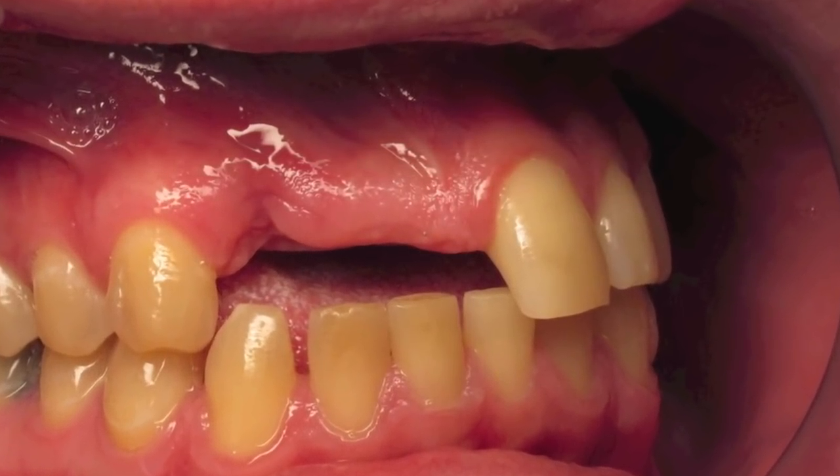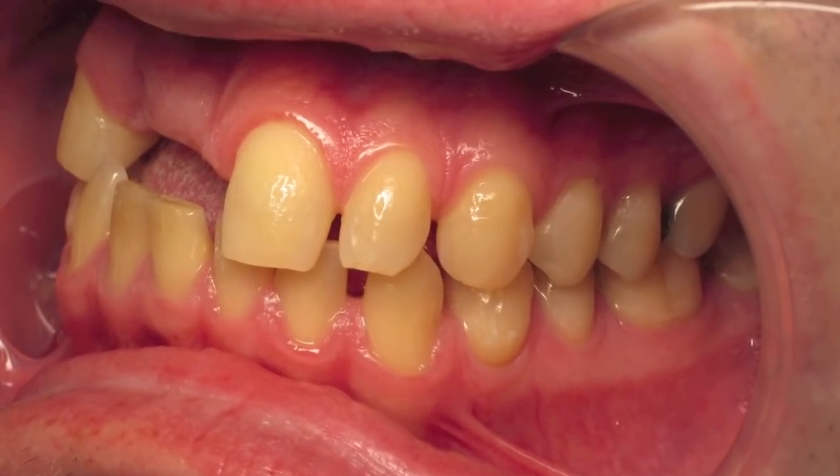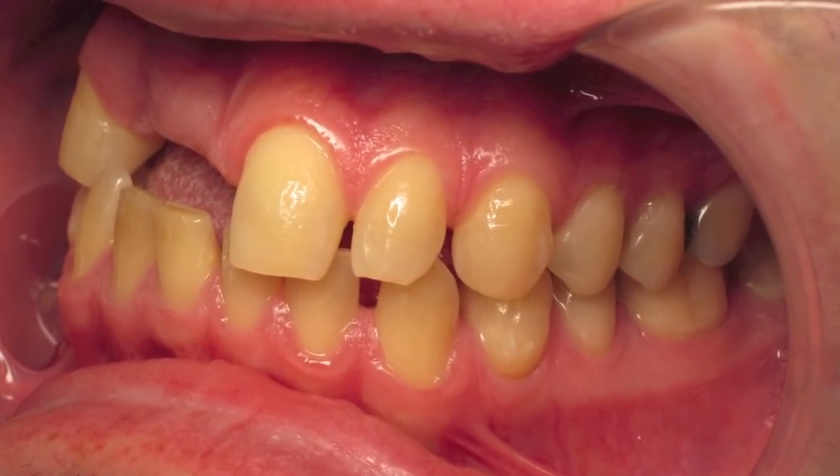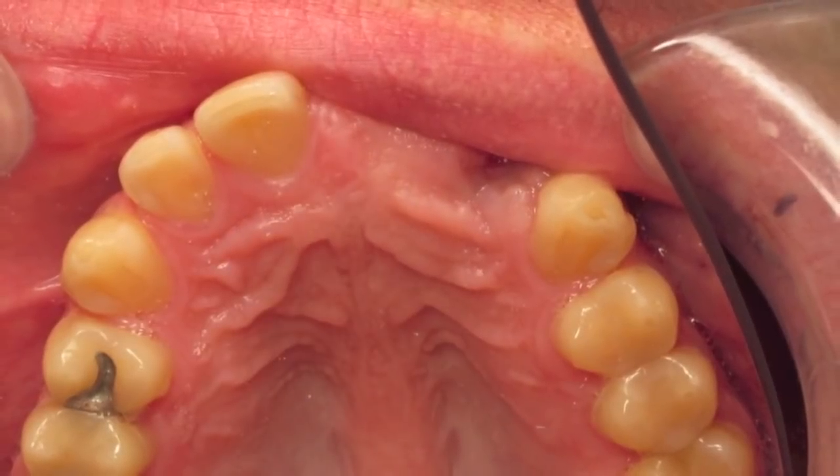This young man had some sort of trauma. Tooth number seven, or one two, was extracted about four weeks ago. So you're going to see me degranulating that socket, preserving it with some Biowass. We're going to be doing a ramus graft here.